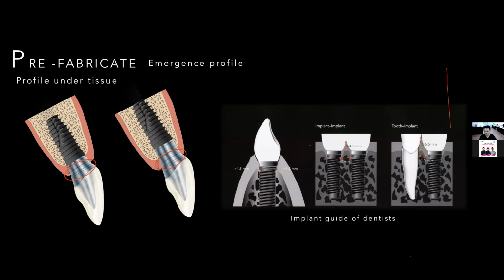So this is interesting. When we want to create the cosmetic abutment, don't make it all convex, because some of the implant is in the bone. If it is too convex, when you put your cosmetic abutment in the patient's mouth, it will contact the bone early. That will make it not easy for your dentist to screw it in and set the cosmetic abutment in the right position.